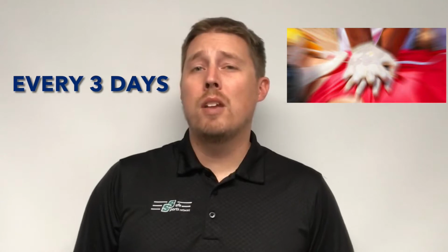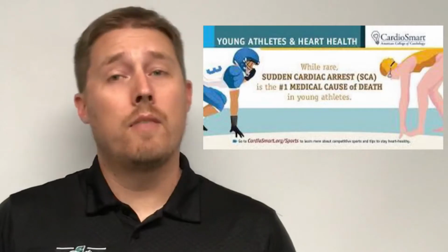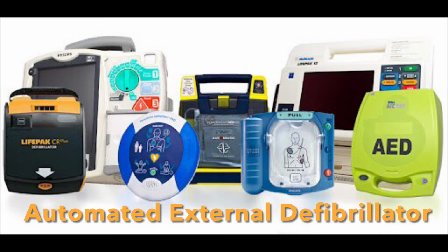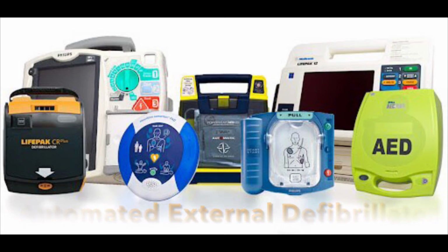Did you know that every 3 days a young athlete in the United States dies as the result of sudden cardiac arrest? In fact, sudden cardiac arrest is the #1 cause of sudden death in exercising young athletes. In this video, we will show you how to use an automated external defibrillator, or an AED. This is a device that is easy to use and can save the life of someone experiencing a cardiac emergency.